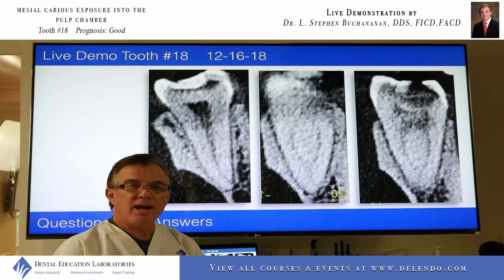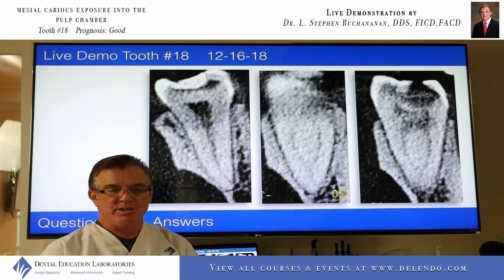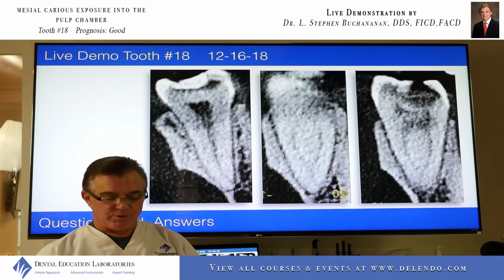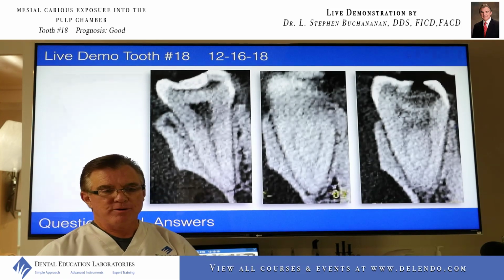So the case, I thought, went pretty well. We've got a beautiful list of questions to answer that were asked. Very relevant, very helpful to other people that are interested in this. I want to start off by showing the finish of this case, however.